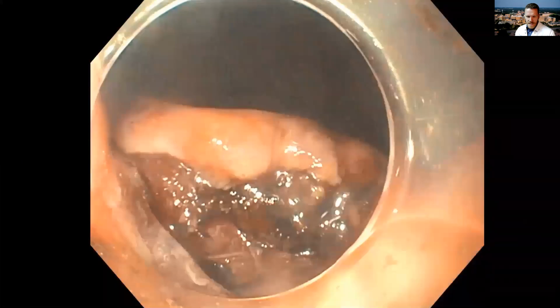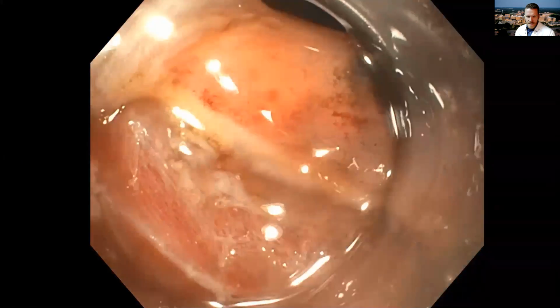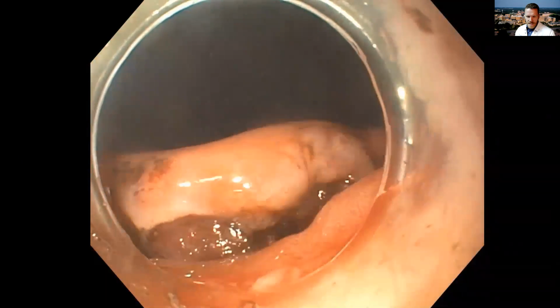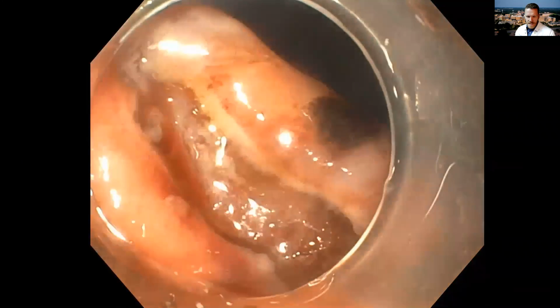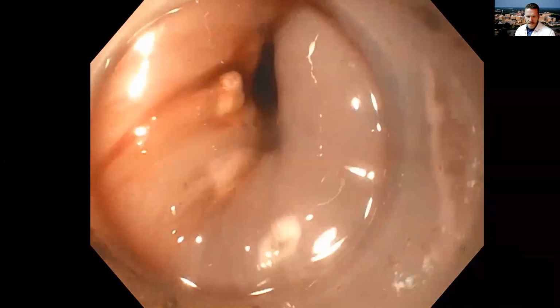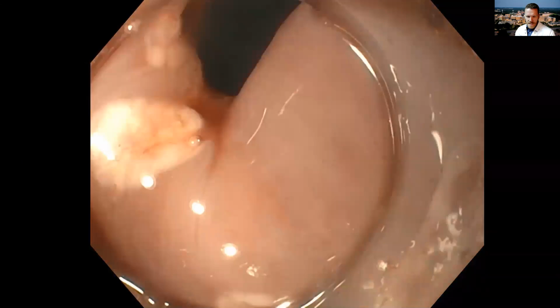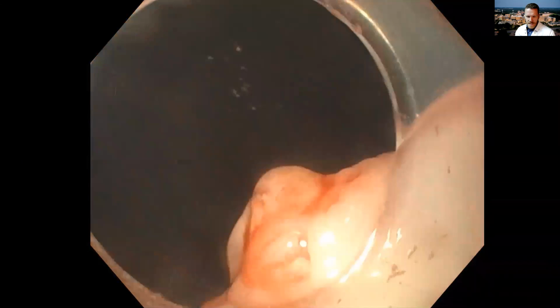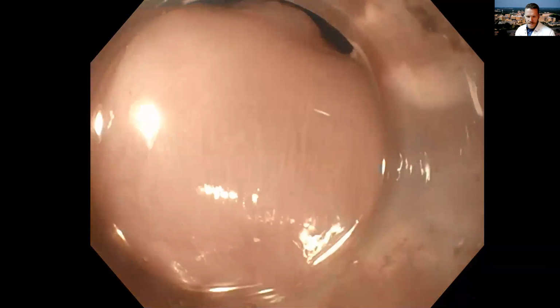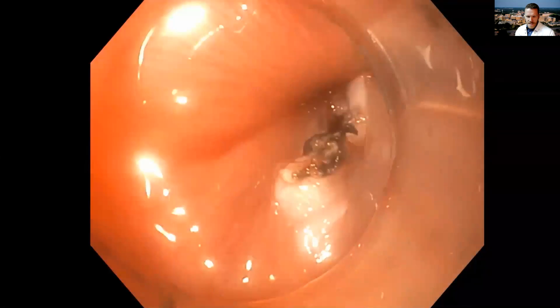So we've gone to the gastric side here. We've made a cut down to, you can see some muscular fibers there, the sling fibers on the gastric side. Now as we back up to gain some perspective, you see the tumor at the 2-3 o'clock area there, rocking around the scope, right? It's got some definite bulk to it.